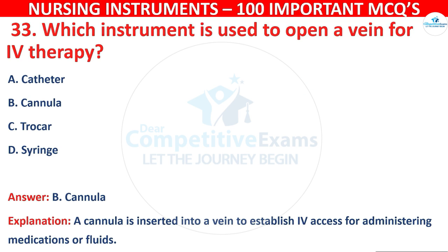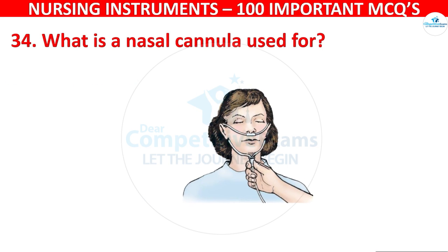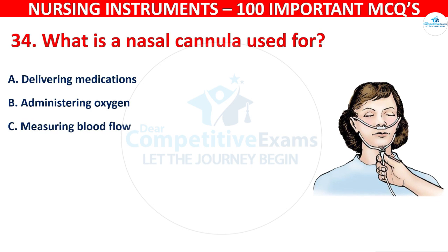Question number 34. What is the nasal cannula used for? Your options are delivering medications, administering oxygen, measuring blood flow, or monitoring heart rate.